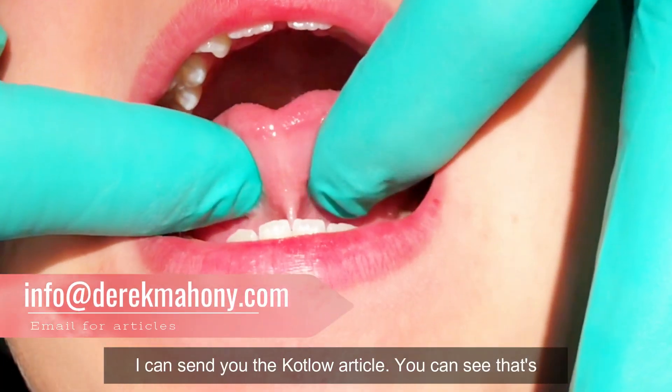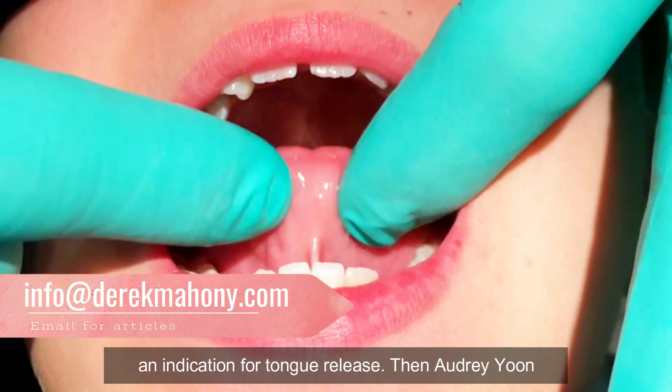If you want more information I can send you the Kotlow article. You can see that's an indication for tongue release.